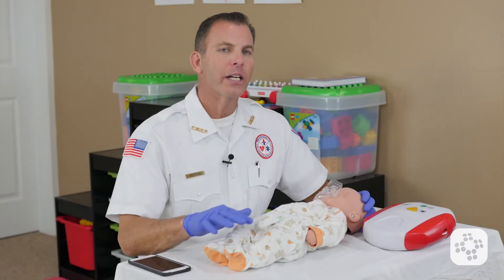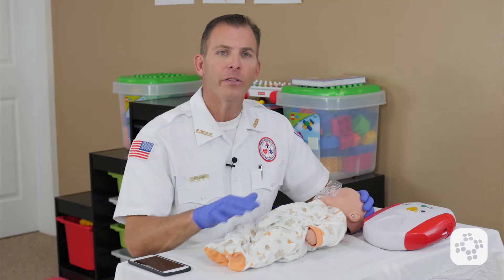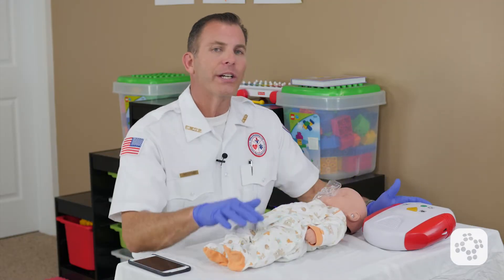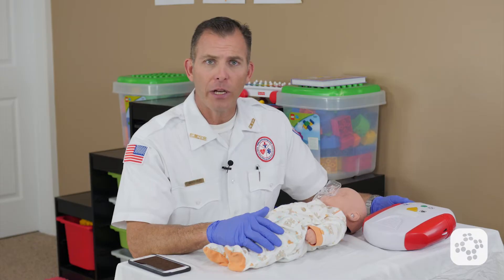Now let's cover the use of an automated external defibrillator, otherwise known as an AED, with an infant while CPR is already in progress. I've either acquired the AED myself or someone's brought it on scene and it's now available.